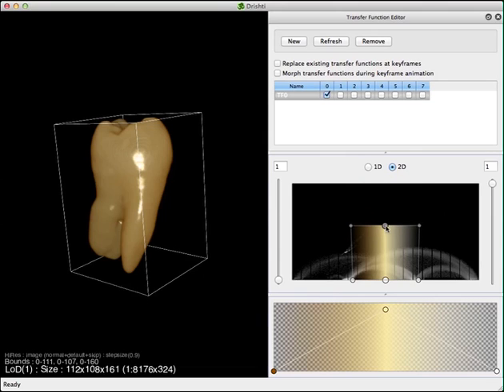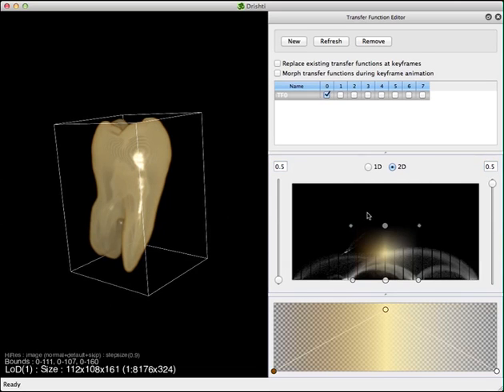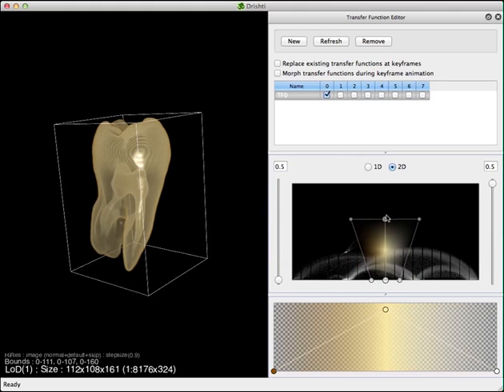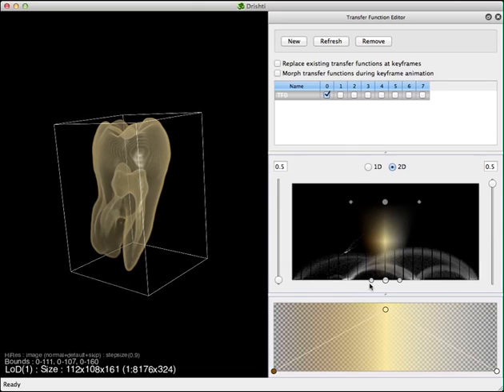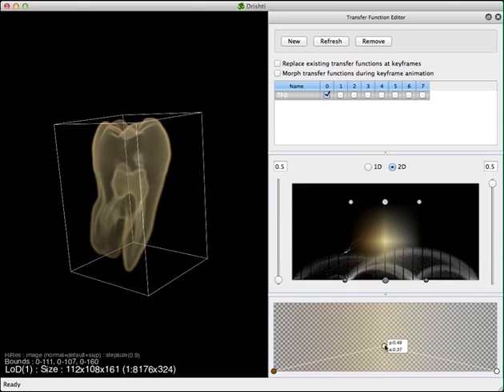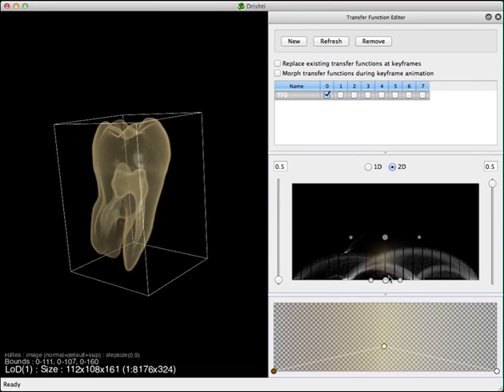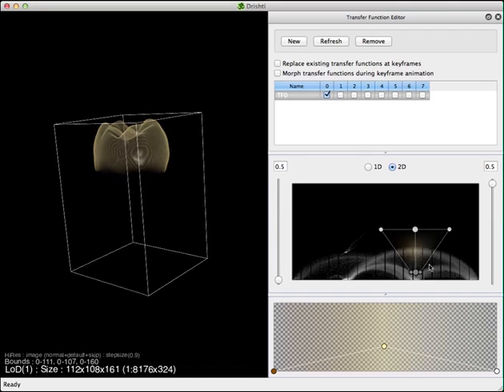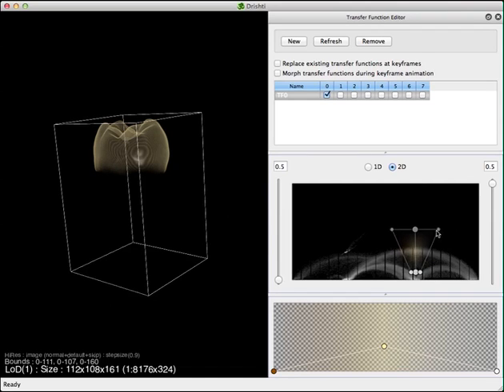Now let me show you what happens when we have 0.5 in each of these boxes. The value 0.5 is special: the opacity is highest in the center and then goes down to zero at the edges — like a Gaussian curve. This is also useful to catch the boundaries.